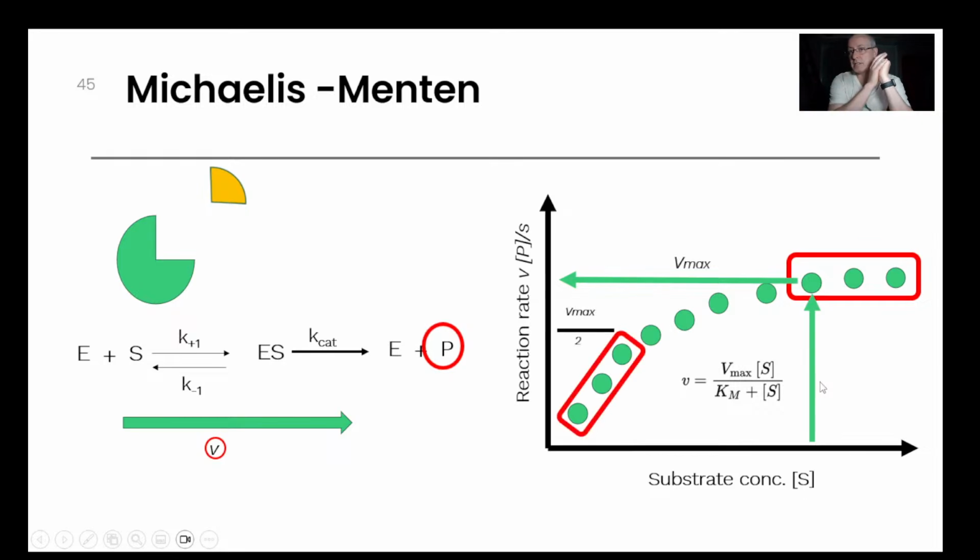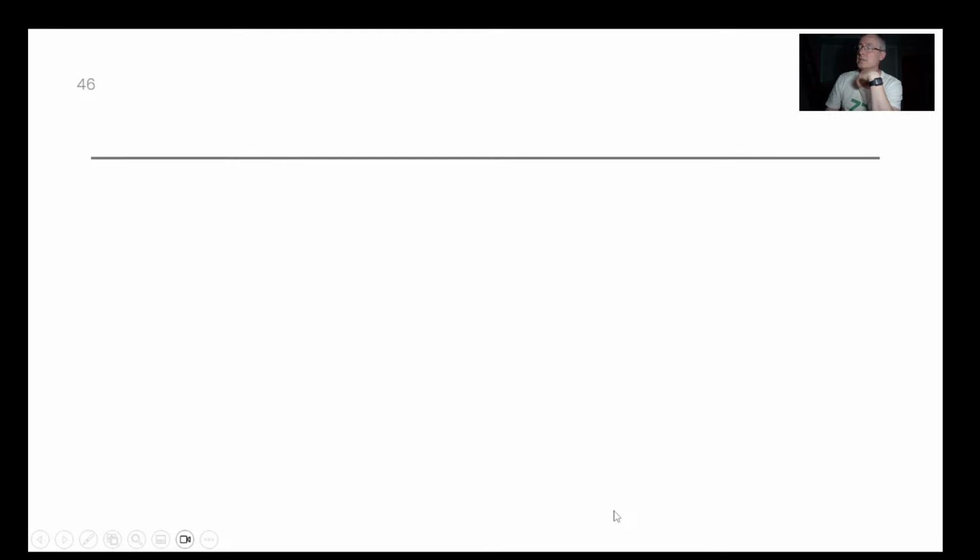The Km is really the half Vmax, but it's also an indicator of where you would find that sensor to be quite linear. So I've got to be careful with this statement. You can have too much Vmax on a glucose sensor and end up consuming too much glucose and producing too much hydrogen peroxide, or consuming all the oxygen in a particular system. So you can end up with too much Vmax. But I tend to want a high Km, because a high Km tends to give good linearity and makes the maths a bit simpler.